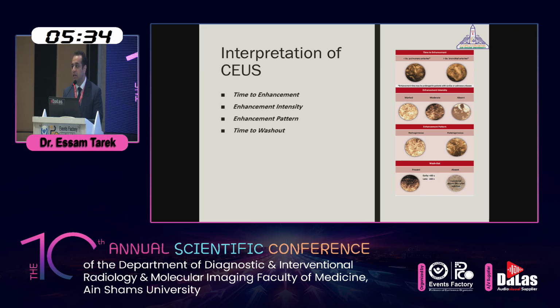And finally, the time of washout. This is the time elapsed from contrast agent administration till the contrast starts to wash out. Early washout is defined as within 60 seconds. So now again, we have two numbers which are very important, 6 seconds and 60 seconds.